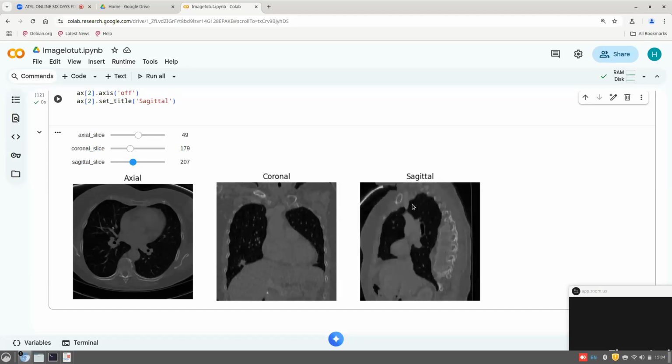So the idea I want to convey is that AI has to detect not only if it is a 3D image like CT scan or MRI, both are 3D images. You have to detect the diseases not only in one image but also along all these slices to tell whether a person is normal or abnormal.